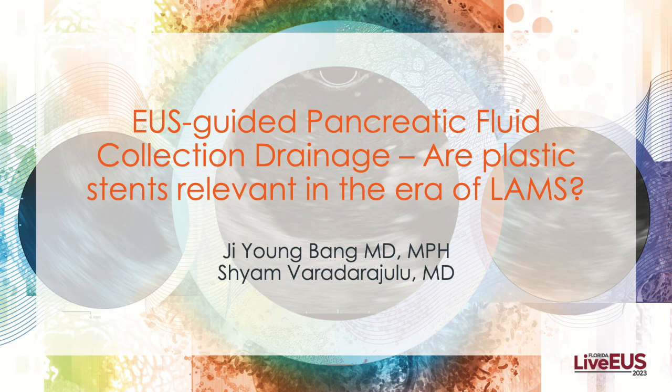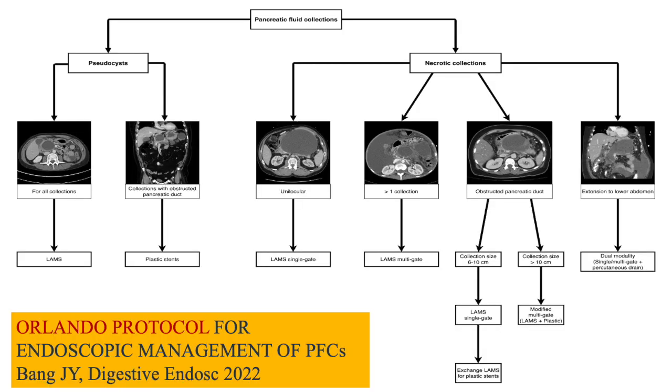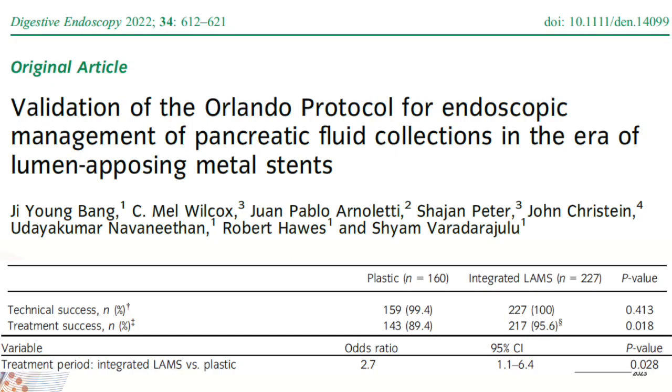In this Florida Live educational video on pancreatic fluid collections, we will examine the relevance and role of plastic stents in the new era of lumen-apposing metal stents. The Orlando Protocol offers a structured algorithm for the management of pancreatic fluid collections using mostly LAMS and plastic stents in specific circumstances that yields overall treatment success in 95% of patients.